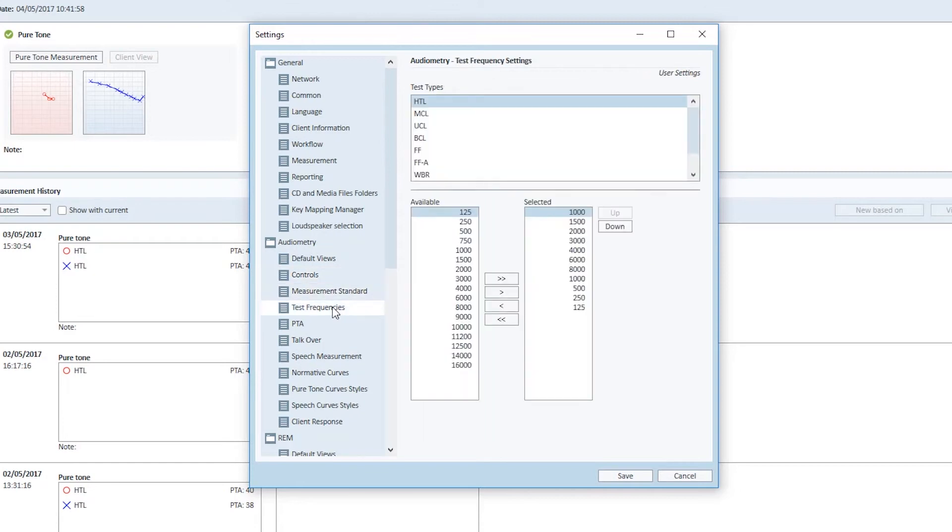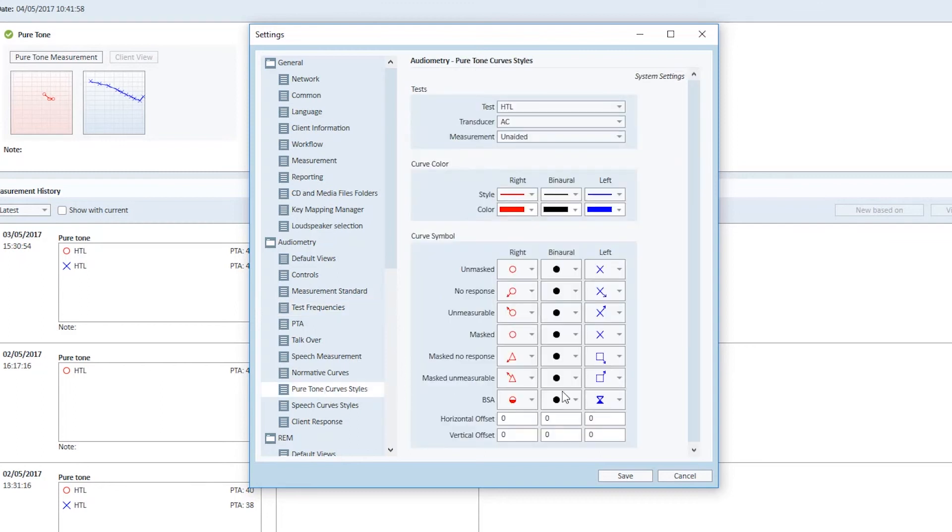Select the test types and set the desired frequency order. You can configure the symbols for the different test types in the pure tone curve styles. Remember to save at the end.